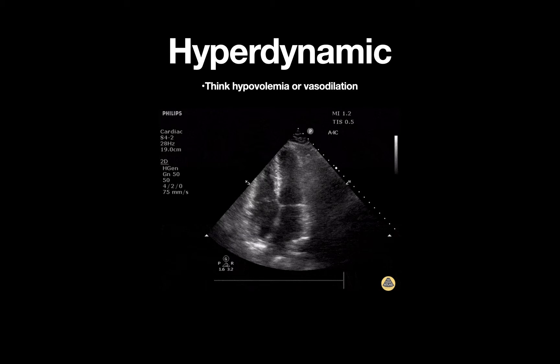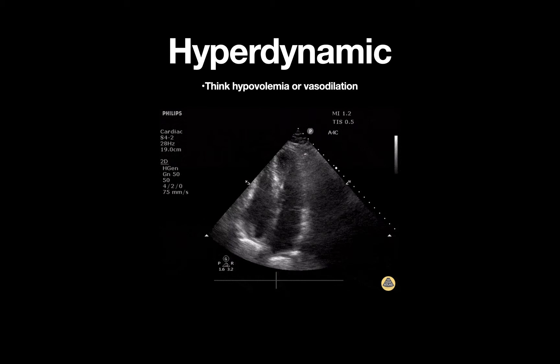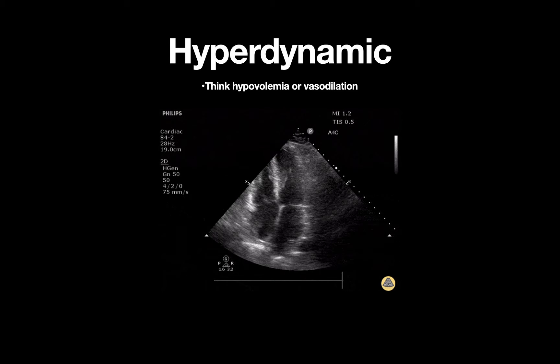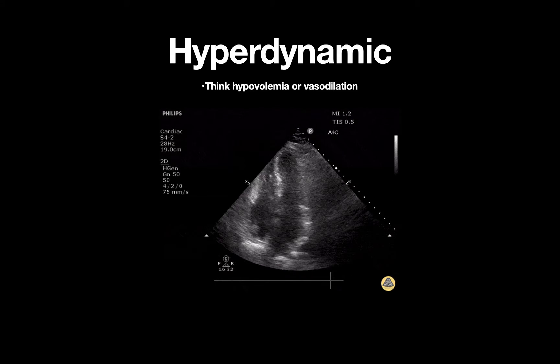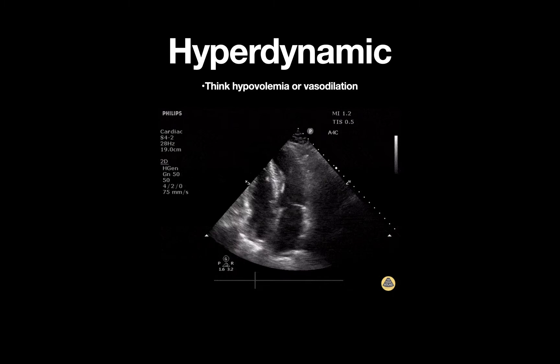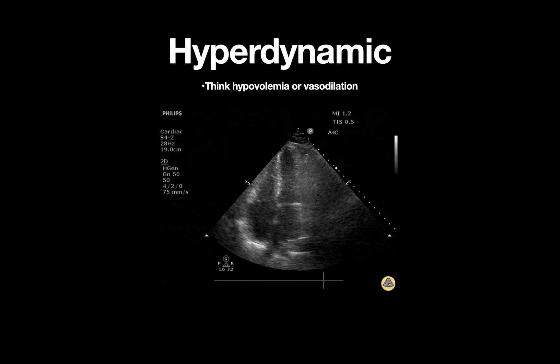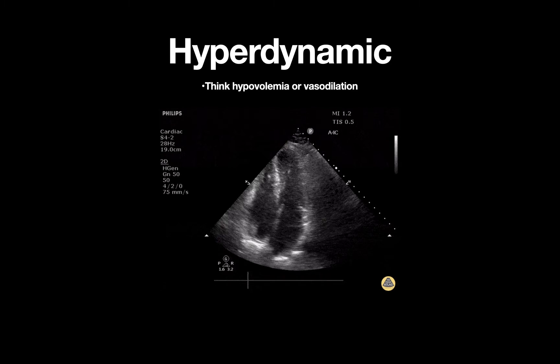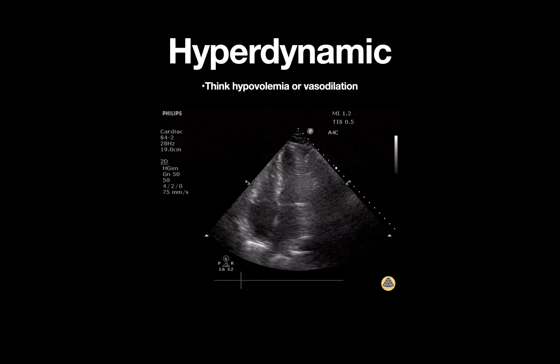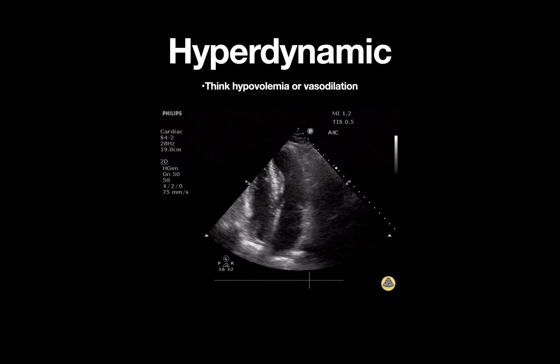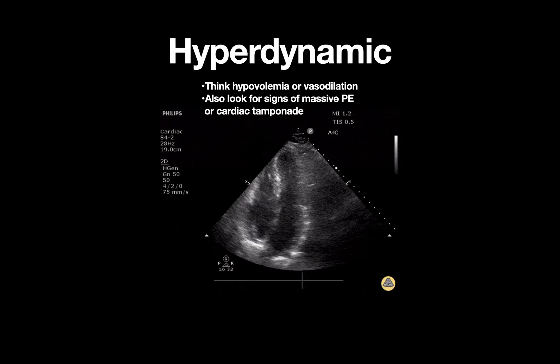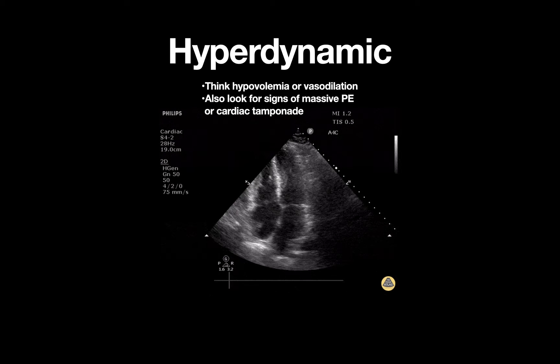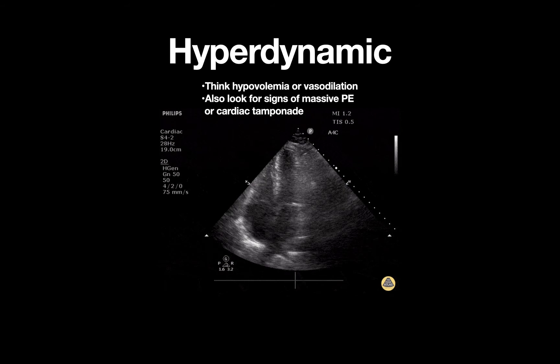While a hyperdynamic left ventricle frequently suggests hypovolemia or vasodilation, other etiologies that can severely decrease preload or afterload should also be considered, many of which will have accompanying abnormal findings on cardiac ultrasound, such as massive pulmonary embolism or cardiac tamponade.